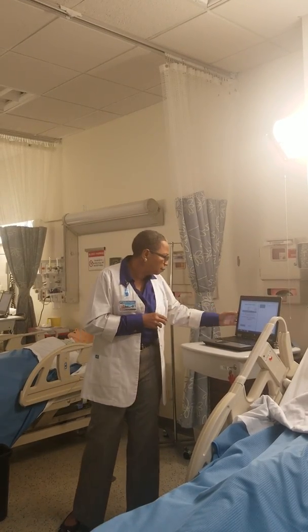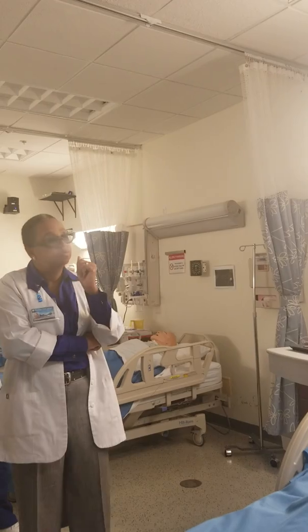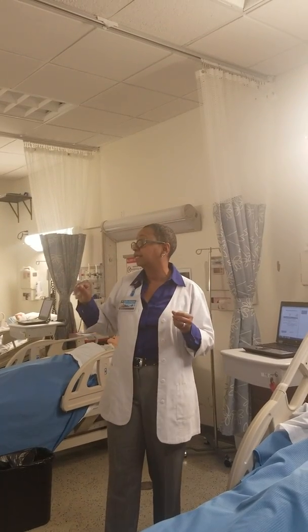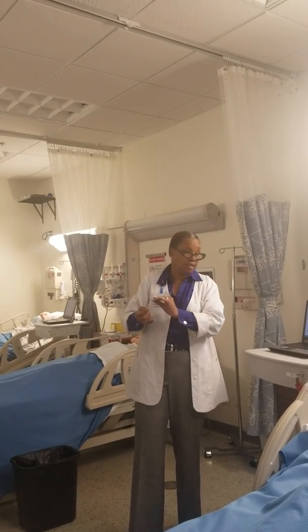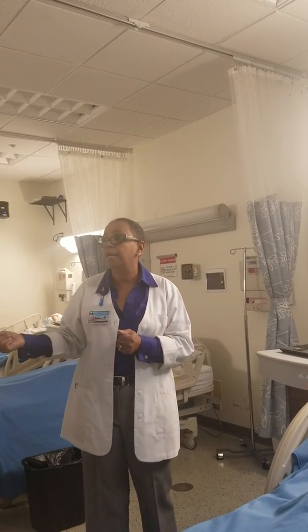Another thing about a central line, if you have a central line, who can draw blood from it? The nurse, and only the nurse. That's your job, okay? If the phlebotomist comes up, and your person does have a line, then you tell them my person has a line. And most times the patient tells them I have a line. Then you can go in according to your protocol, because some protocols don't want you to draw from a PICC line, because that's a narrow lumen and you might clot it off. But if your protocol is that you can draw blood from your central line, then you have to draw it. You can't send a phlebotomist in there to draw blood from your line. What you can do is draw the blood, label it in front of the phlebotomist, and then they take it down to the lab or whatever. Okay, does that make sense?